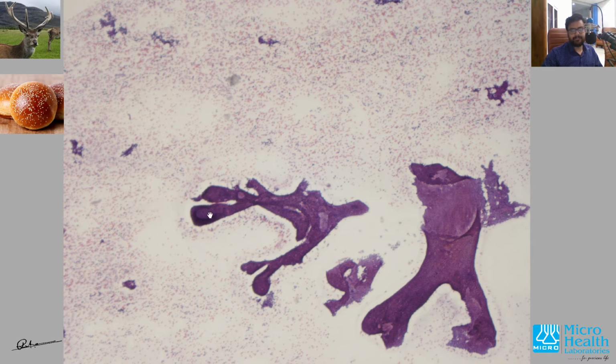If you look here, it has that kind of appearance. If this was the face of a deer, this would be an antler-like appearance. So that is the antler-like appearance. The sheet we also already saw.